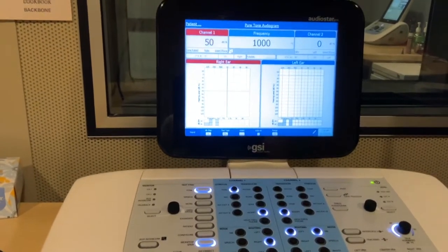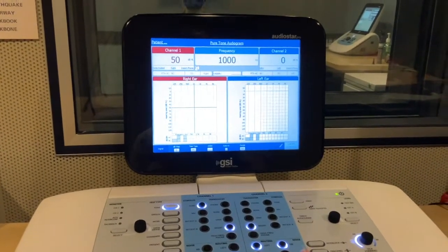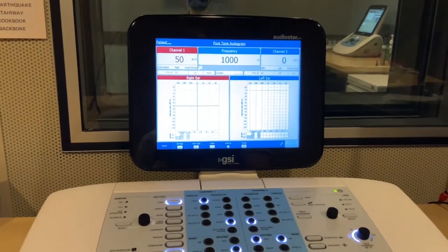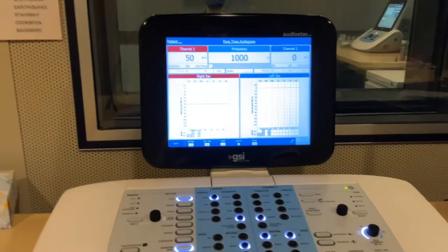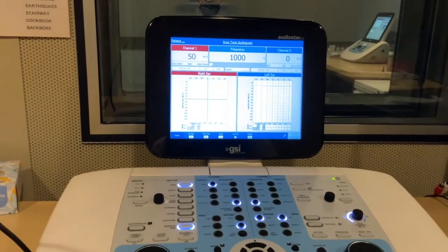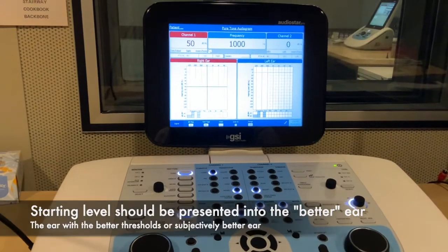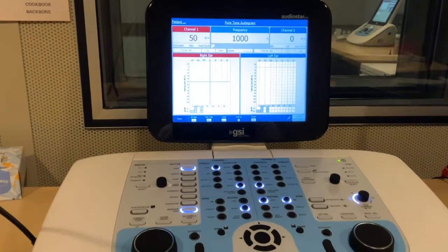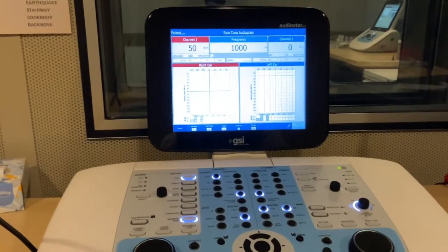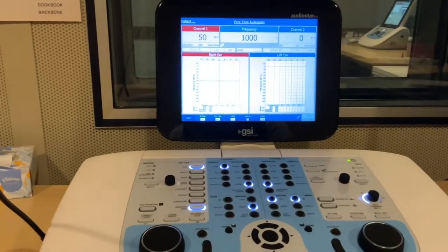Generally with someone without hearing loss, there's no ear necessarily that we need to start in if they have normal hearing in both ears. But if you have an individual with hearing loss, you want to start in the quote unquote better ear. So the ear that has the lower thresholds is the one you'll start in. But for Emily, both ears are about the same, so it's fine that we just start in the right ear.